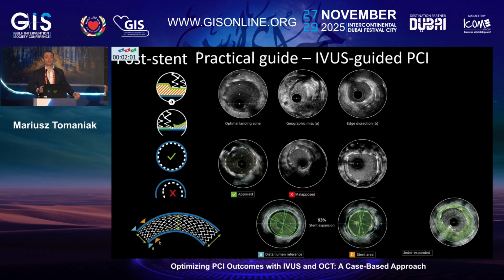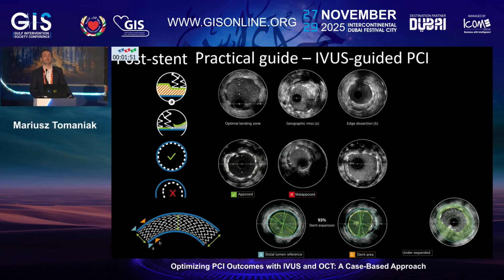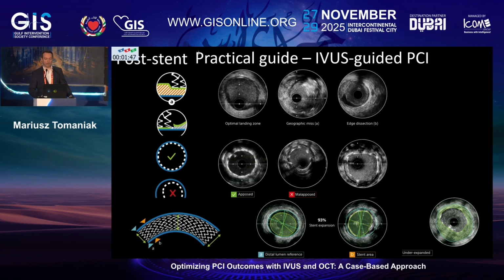But both high definition and the standard version of IVUS will allow us to confirm the landing zones, whether we cover our lesion completely, where our struts are apposed, and most impactfully, whether we have our stent well or not well expanded.